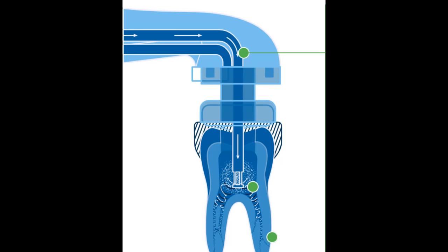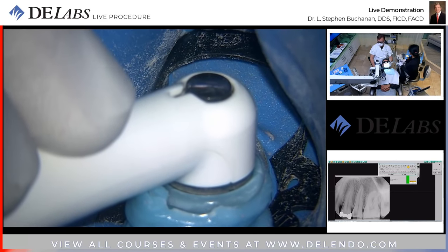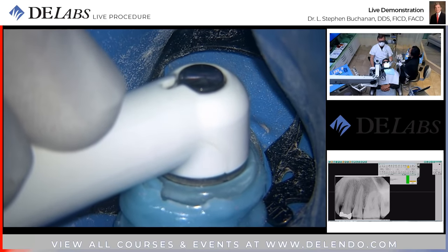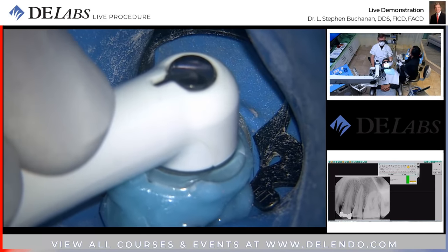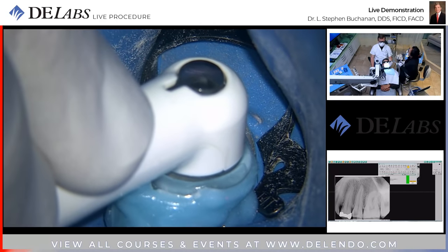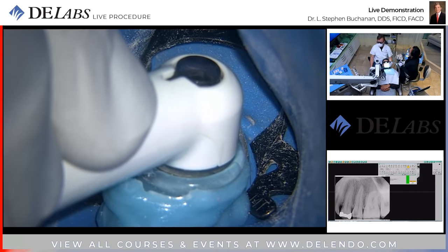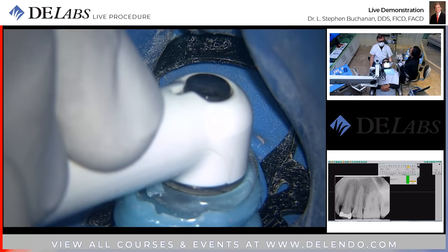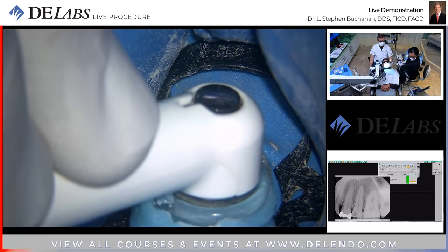Okay, that's a minute of smear layer removal. Just about done. Awesome patient here. So the advantage of GentleWave for endodontists is most dramatically taking a two-visit endo practice into single visit. The productivity is much better. Patients don't want to come back a second time. And now we don't have to worry about irrigation failures because of the efficacy of this multisonic device. We're at a minute and 45. Just about finished. It's going to do a 15-second rinse. Two, one, zero, and that's it. It's now rinsing, a little short rinse cycle, and we are ready to obturate.